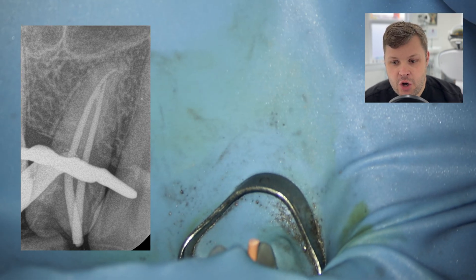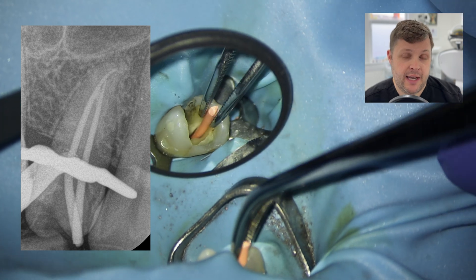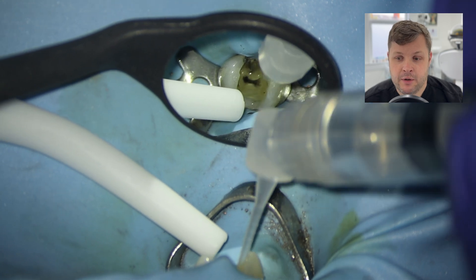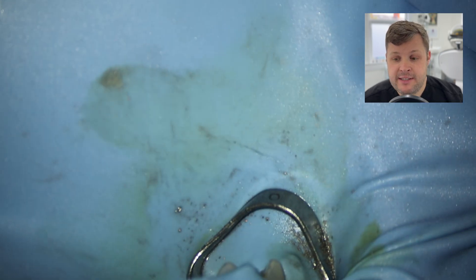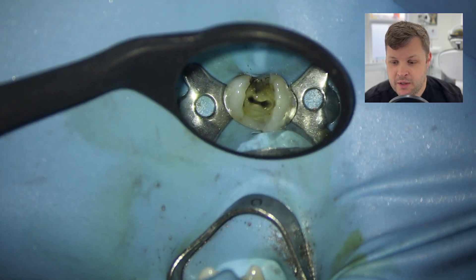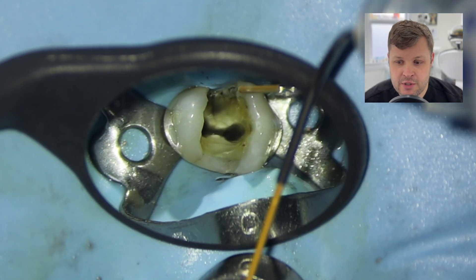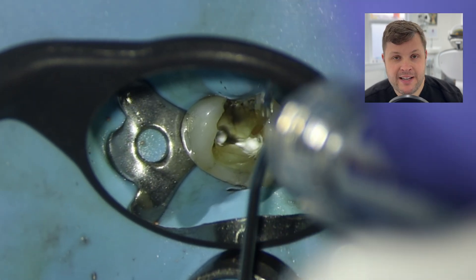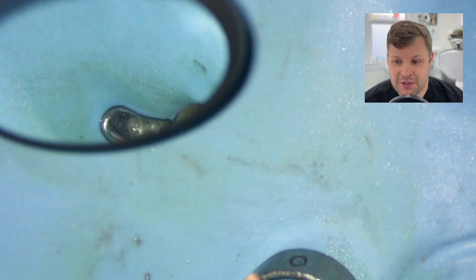Now I disinfect the GP points and complete the disinfection protocol: sodium hypochlorite activated, then 17% EDTA activated, then a final rinse of sodium hypochlorite activated. We're now ready to obturate. I'm using OneFile with visco tips to deliver this bioceramic sealer nice and easily into the canal space. As I place the OneFile sealer, you'll notice both canals fill — an obvious visual confirmation that the two canals are joining.